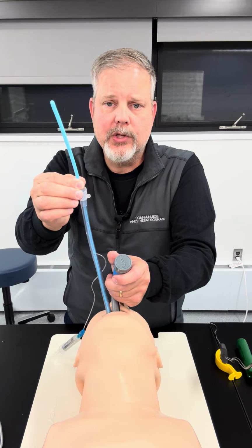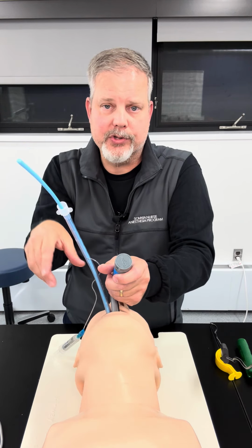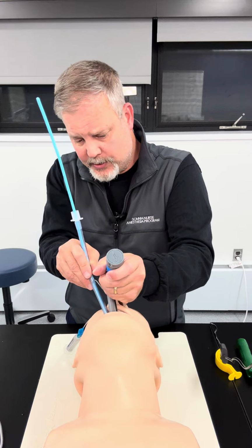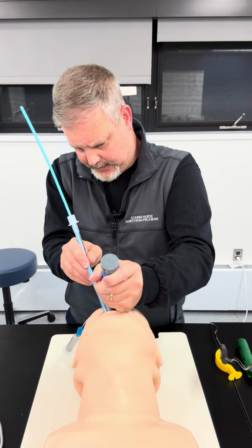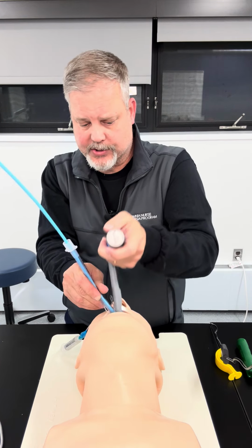You want them to hold the bougie so that it does not slide further in or slide out and lose your spot. Then I'm going to continue to visualize and watch my endotracheal tube go through the vocal cords as I'm placing this tube.